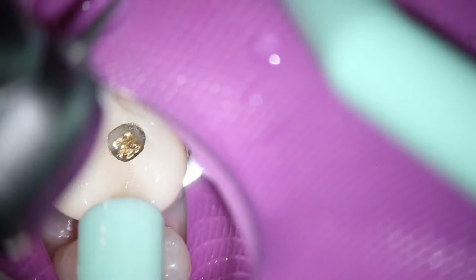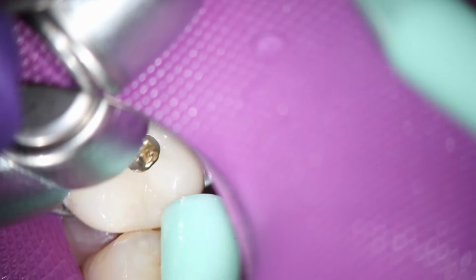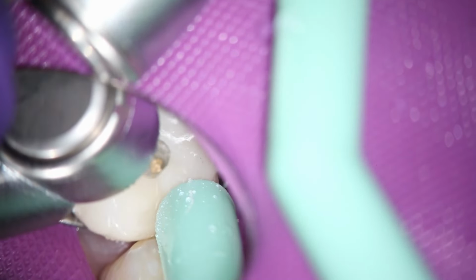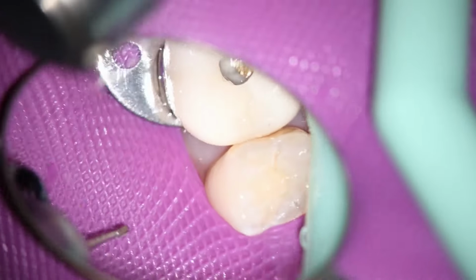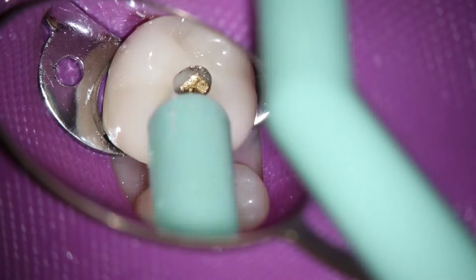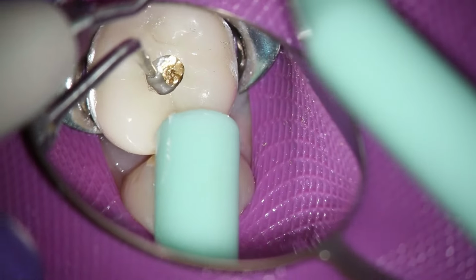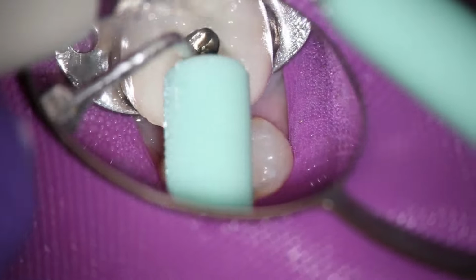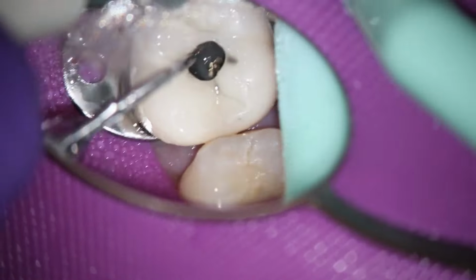Now I've got to make a very accurate access here. I've got to drill, remove the composite around the post and then remove the post without making a huge access in the tooth. And again, I'm able to do that. And not once in this procedure has Joy had to go clean my mirror off. So it's a much, much more efficient way to work.